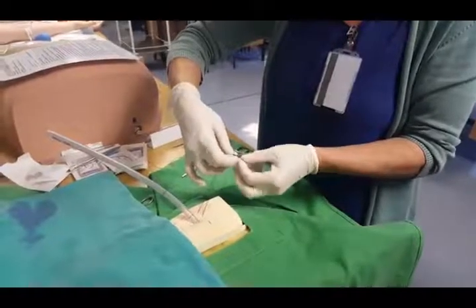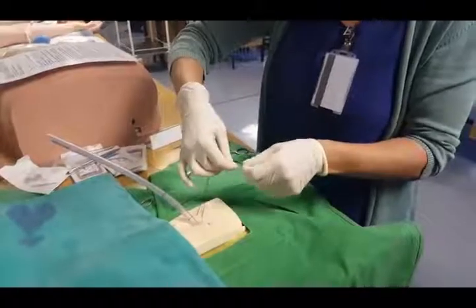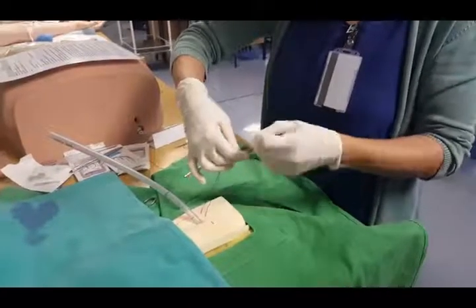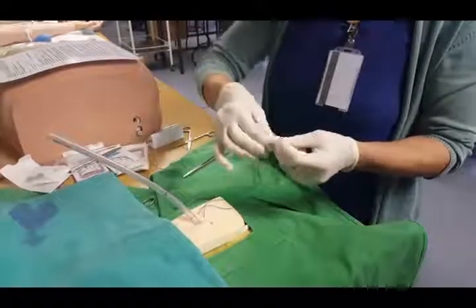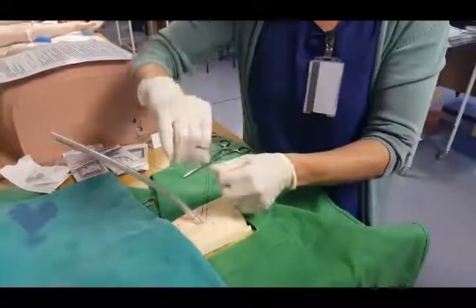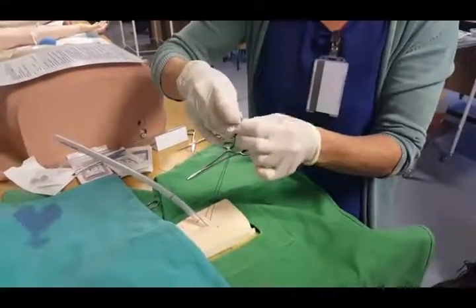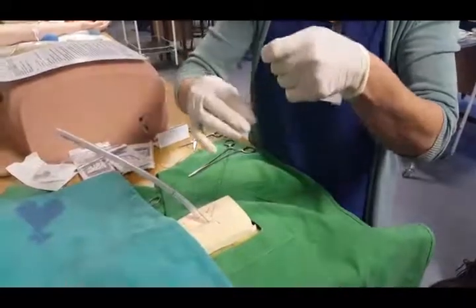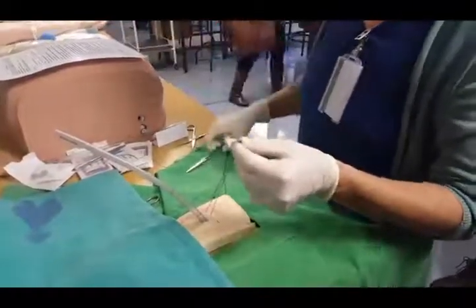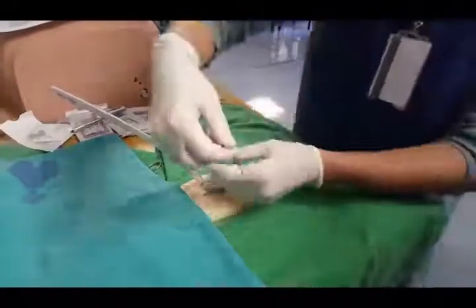Okay, so this is not my forte — I'm not great at this. It's pretty much halfway up. Obviously Elmira does it in a far more professional way because he does a lot more chest drains than I do.